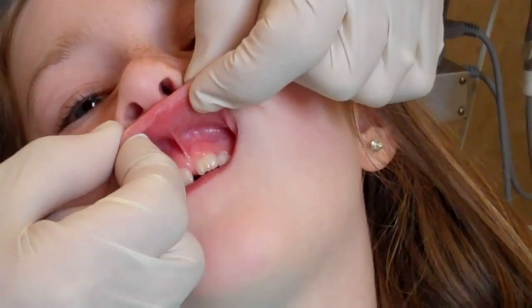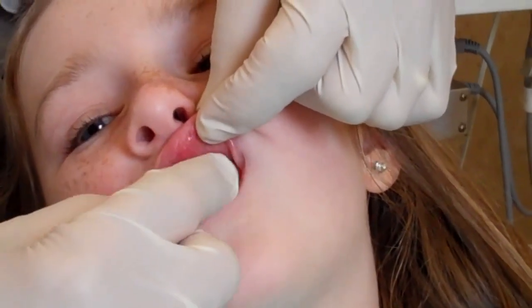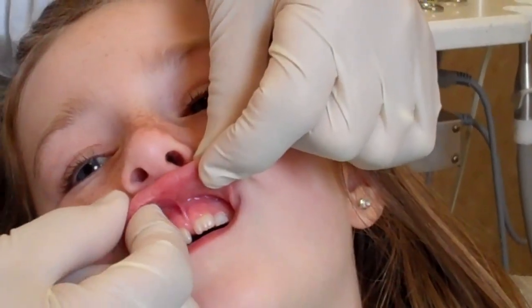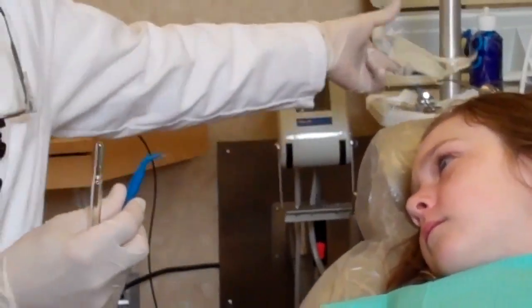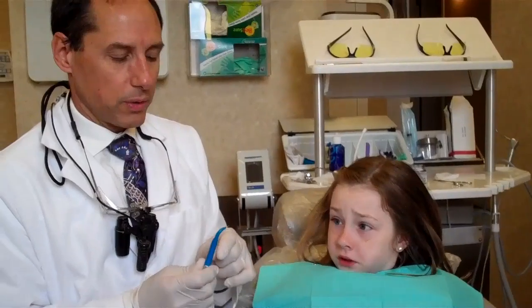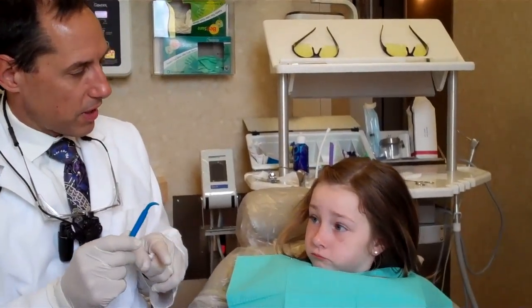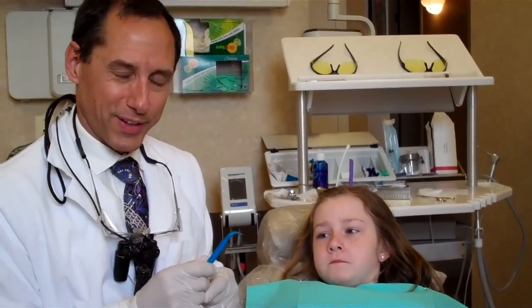They'll at least have a chance to start closing up. We're going to do this with the laser, and we're just going to use a little bit of anesthetic — just a little drop of numbing — and she won't feel a thing. It'll be a nice procedure for her. The laser uses light energy that comes out of the end; I won't even be touching it, I'll just be waving it across, and it'll be vaporizing the tissue with no bleeding at all.